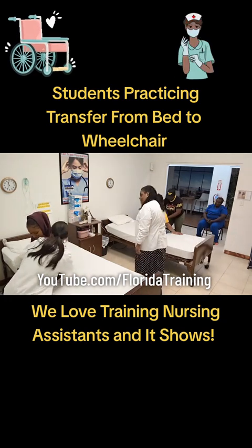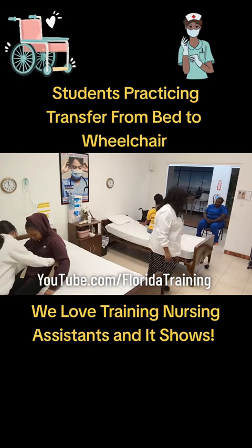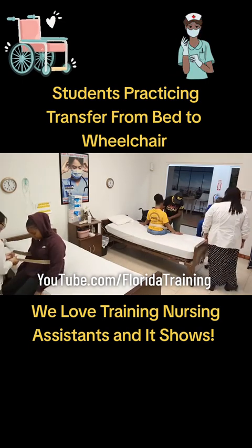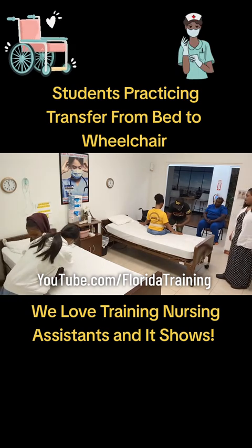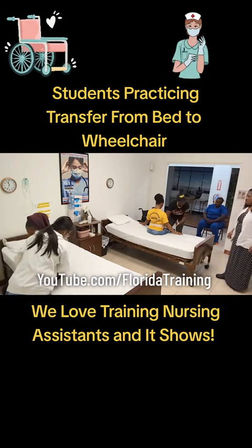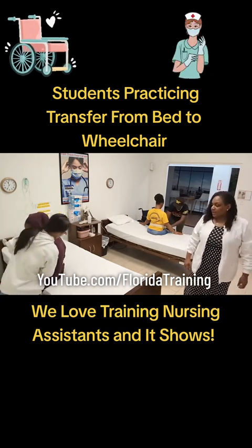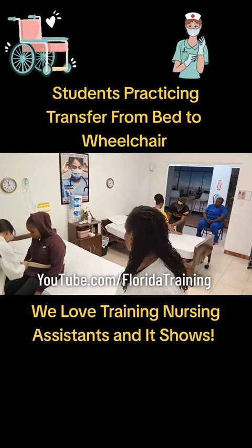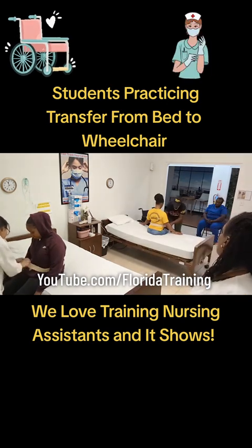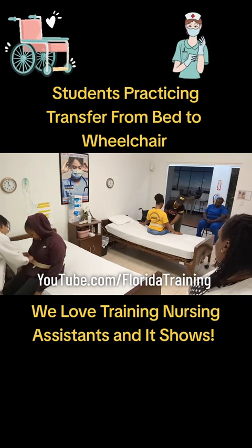She's going to figure it out. At the test site, your nurse warns the resident — if you touch the belt, you do more than what you're supposed to do because this is a CNA's task. CNA, don't secure that belt yet because it's not tight. Put your two fingers on the inside, hold that buckle, get that belt low and tight. Put the buckle in the front — it's easier to work it in the front.